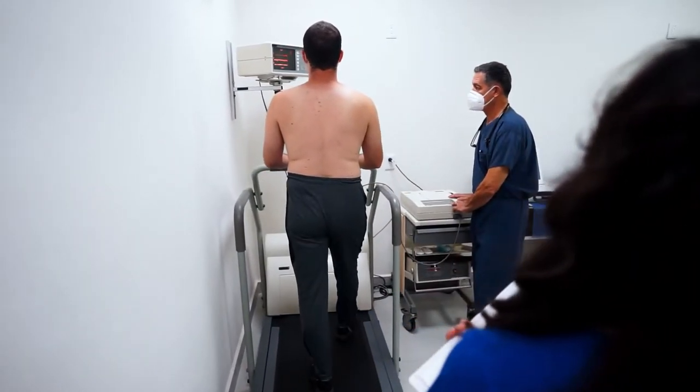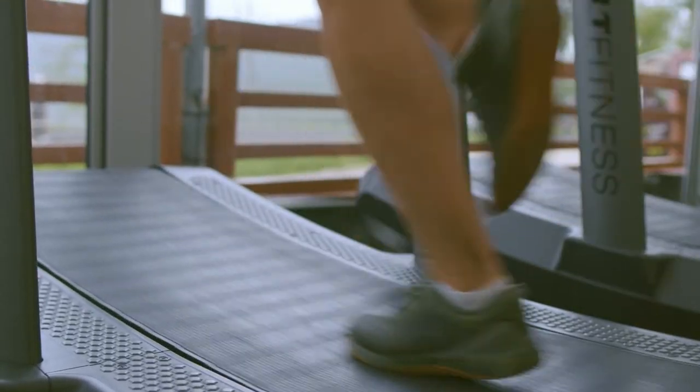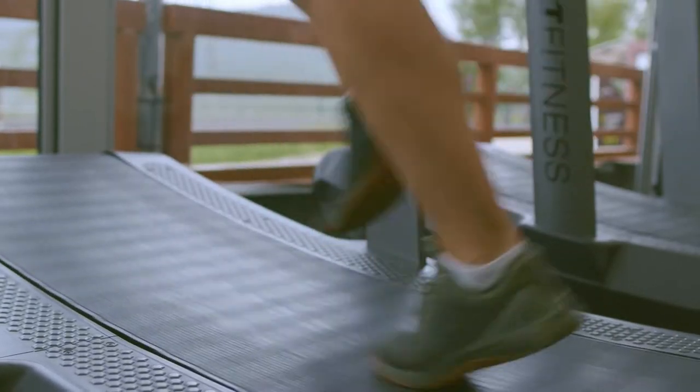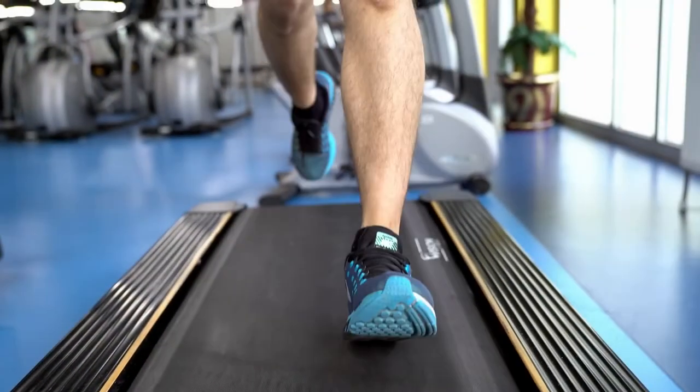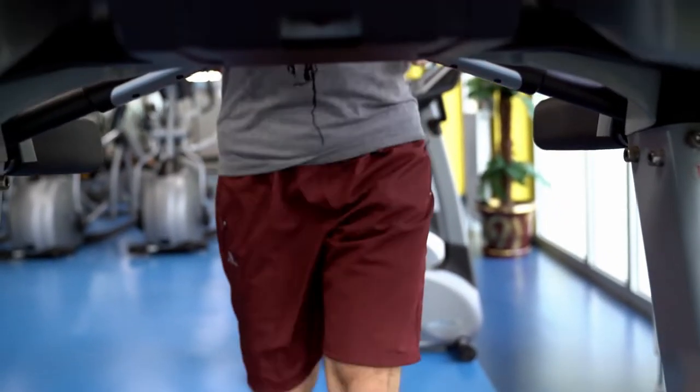What is the importance of METs? METs, or metabolic equivalents, represent the amount of exercise the patient has done — how many times the normal resting effort the patient can tolerate. At rest it is 1 MET, walking slowly is 3-4 METs, and walking briskly is 6-7 METs. Based on the METs achieved, we can tell the patient their effort tolerance, their long-term risk, and the chances of having a long-term problem based on how many METs they achieved on the treadmill.